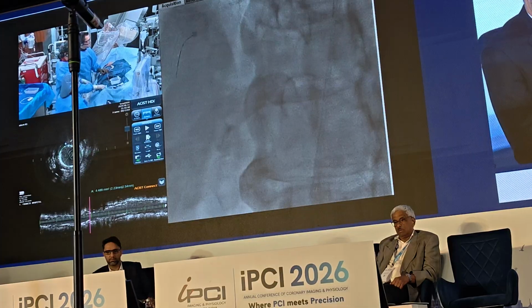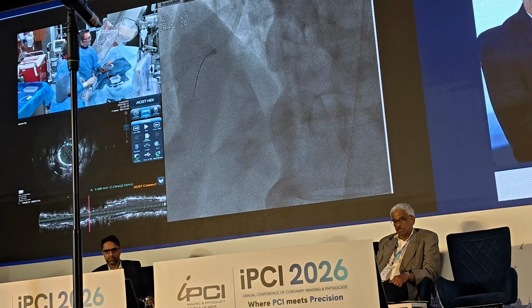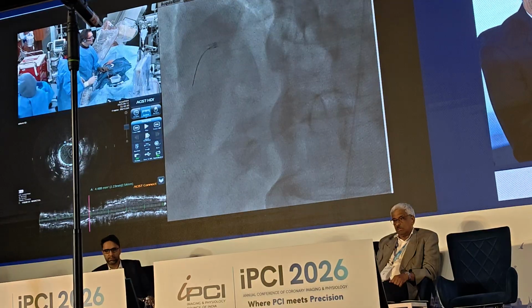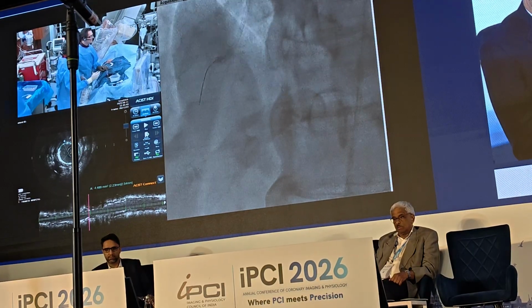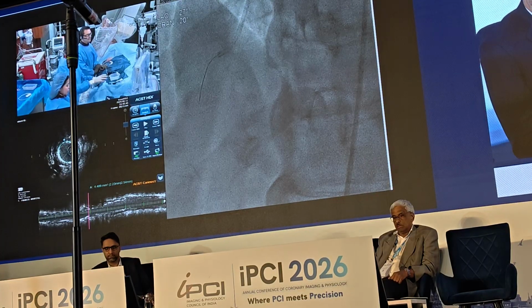We don't want you guys just having a final shot. So you want to see the angiogram, right? So we'll give you a little bit. Let me just flush it. What we do with the Assist is we just give a little puff until we see, because we're recording every measurement, okay? So some contrast just went in.